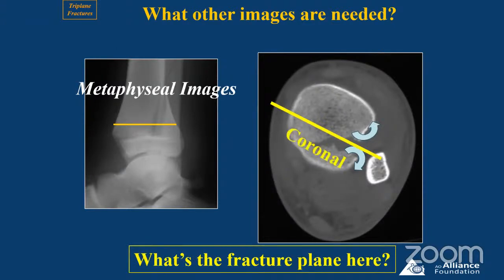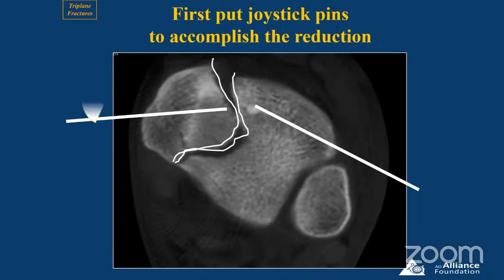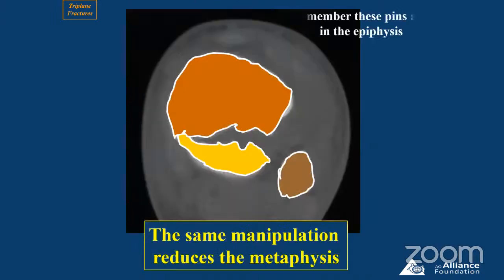So how do you reduce this when the two fractures, though continuous, are in different planes? So you can joystick them. What you do is you put two K wires into the epiphyseal fragment. Don't touch the metaphysis. Okay, put a K wire into the epiphysis and close the book. Pull them towards each other. When you close them, they will close this sagittal plane, and then you push the pins across so that they stabilize. You do nothing in the metaphysis, but the same maneuver will reduce this automatically. The pins are in the epiphysis, but the metaphyseal fracture also will close.